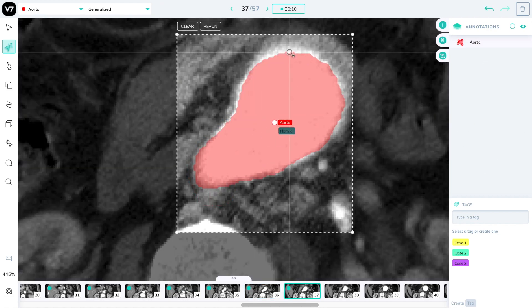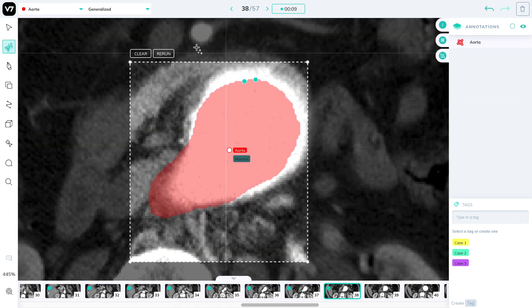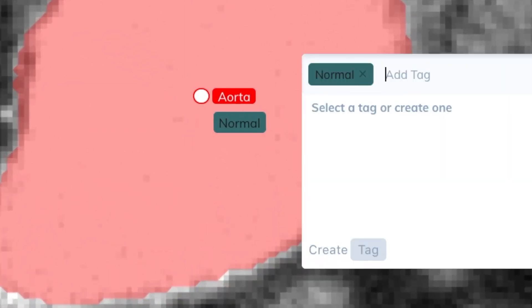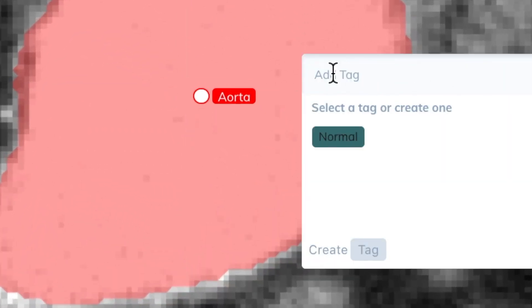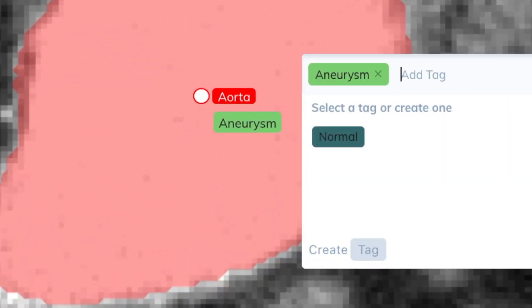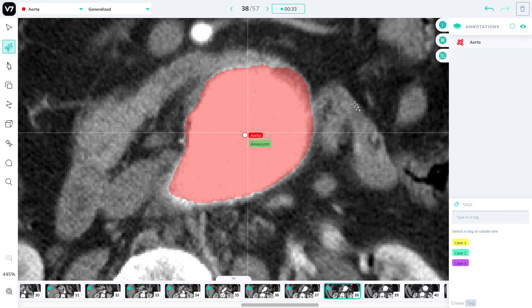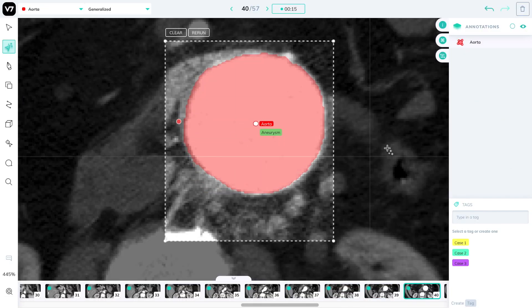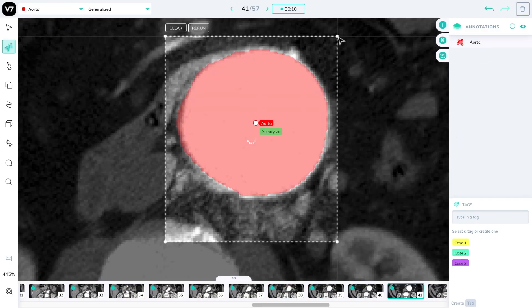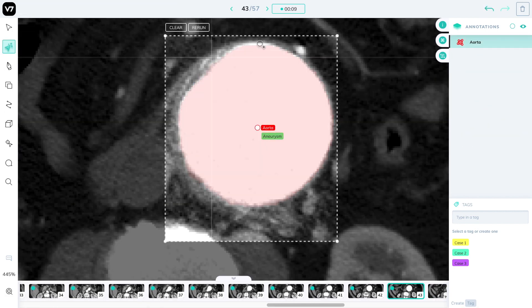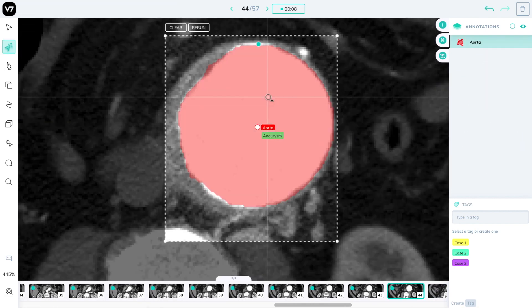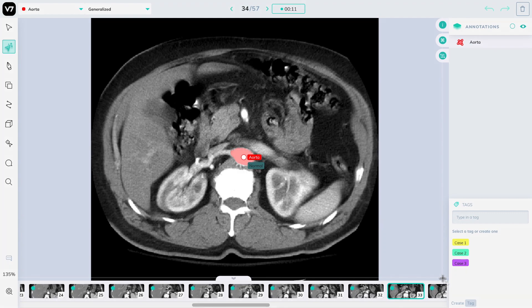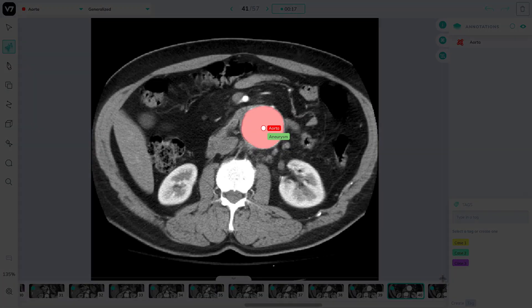Until ultimately it starts to become evident that something is wrong. We'll edit the attributes for this, remove the normal attribute, and add an aneurysm one. We'll continue to track the aneurysm by copying over the annotation with this attribute appended to it and let auto-annotate adapt to the new slice shape. After about 5 minutes we have a complete segmentation of the aorta in 3D slices.